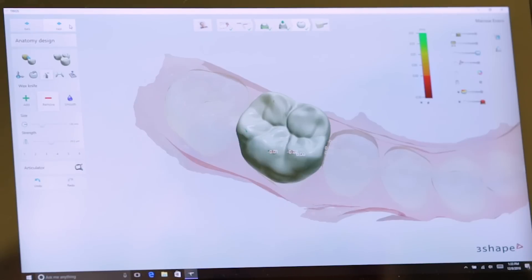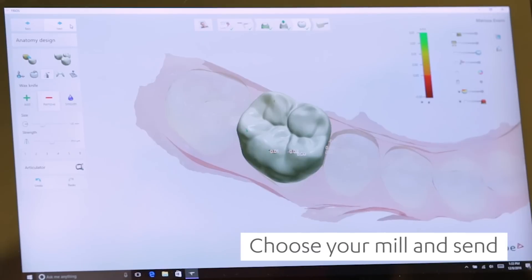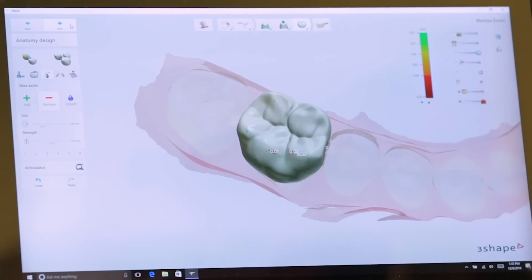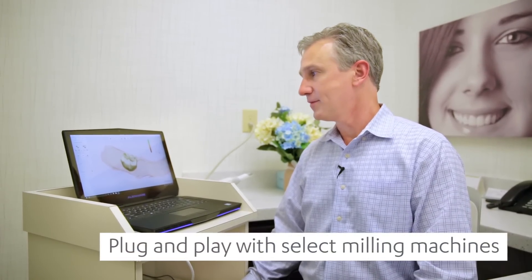Once your crown is designed, the next step is sending it to your mill. When you hit the next step, you can choose which mill it goes to if you have multiple mills in your office — the software does support multiple mills. Once that's done, you're complete. You're done with your design and the rest is just up to the mill. As you can see, in a short period of time you can easily design a crown in-house and send it to your mill for completion.